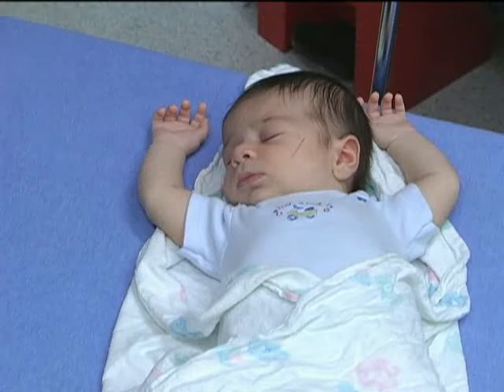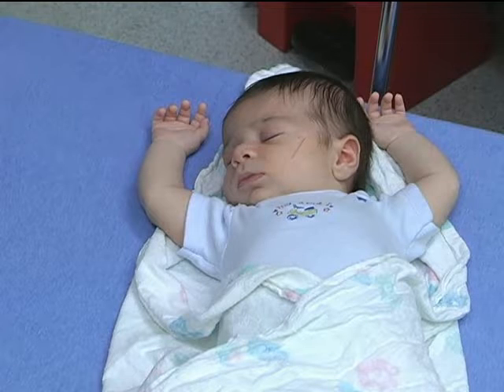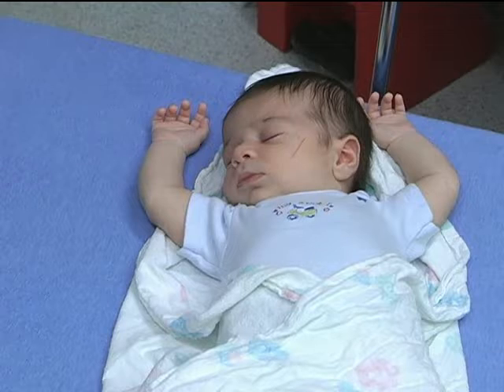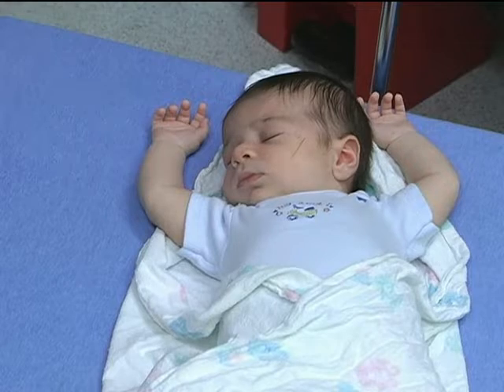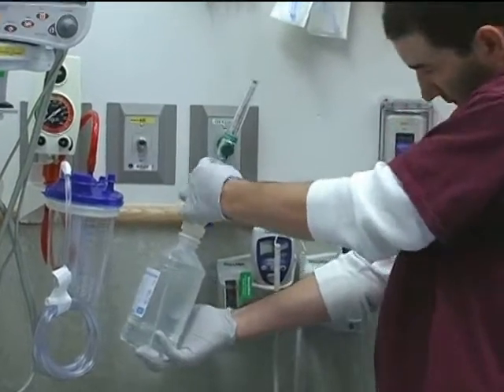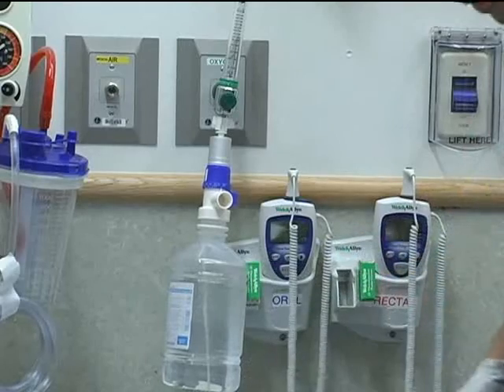In young children, devices placed directly on the nose and face may cause increased agitation and hinder oxygen delivery. In such cases, it may be wise to start oxygen delivery with a passive system, such as hollow plastic tubing with a flow of oxygen passing over the child's nares and mouth. Here we see blow-by oxygen connected to a continuous oxygen source in line with a humidification device.